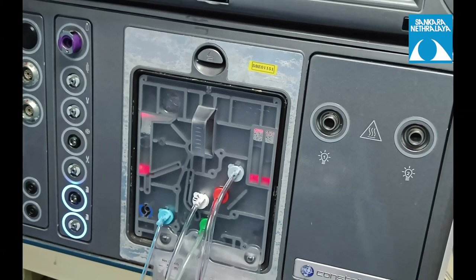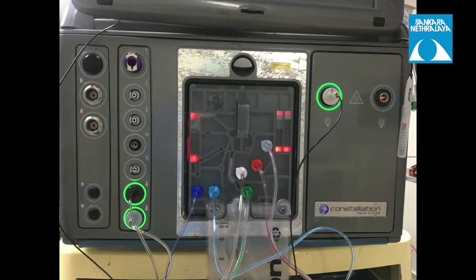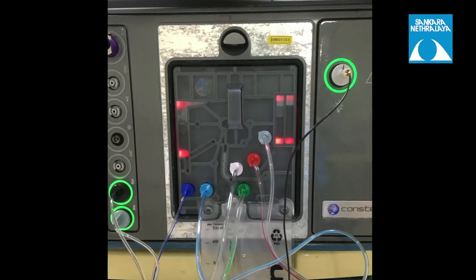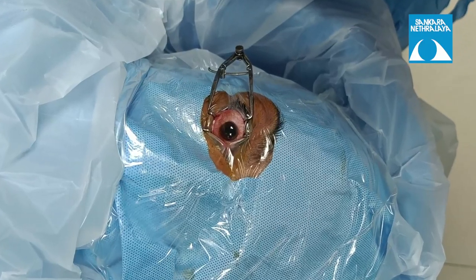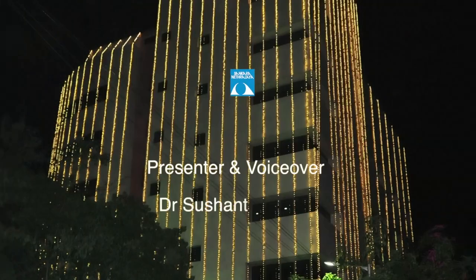All connections and the infusion line are checked, and the machine should be primed before the anesthetist blocks the eye. The surgeon may then take over and proceed with the surgery. Thank you.